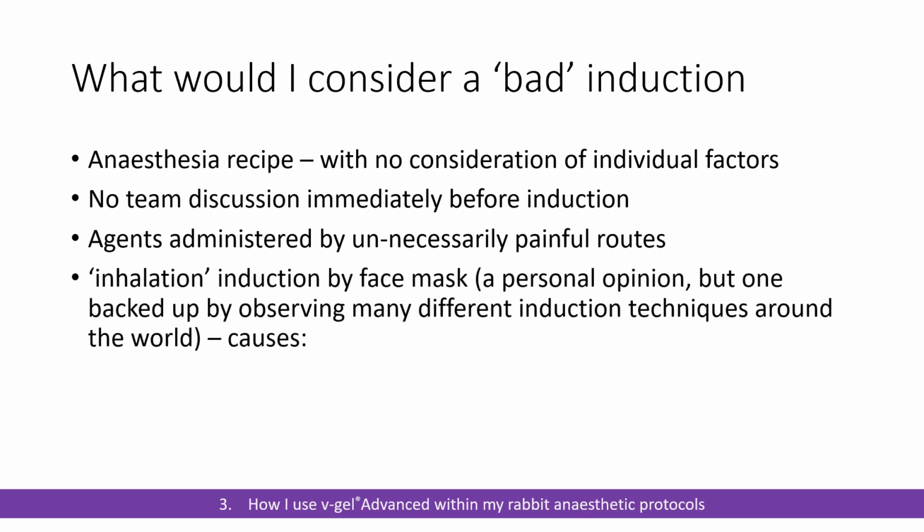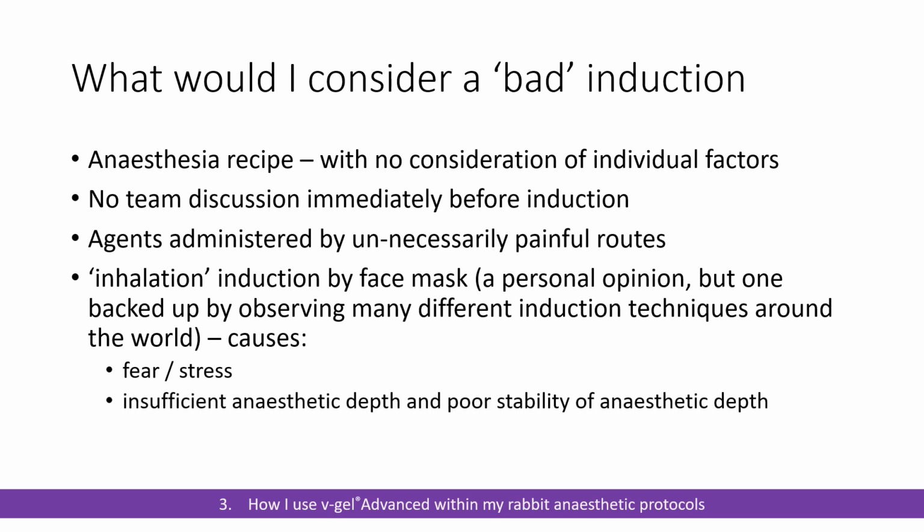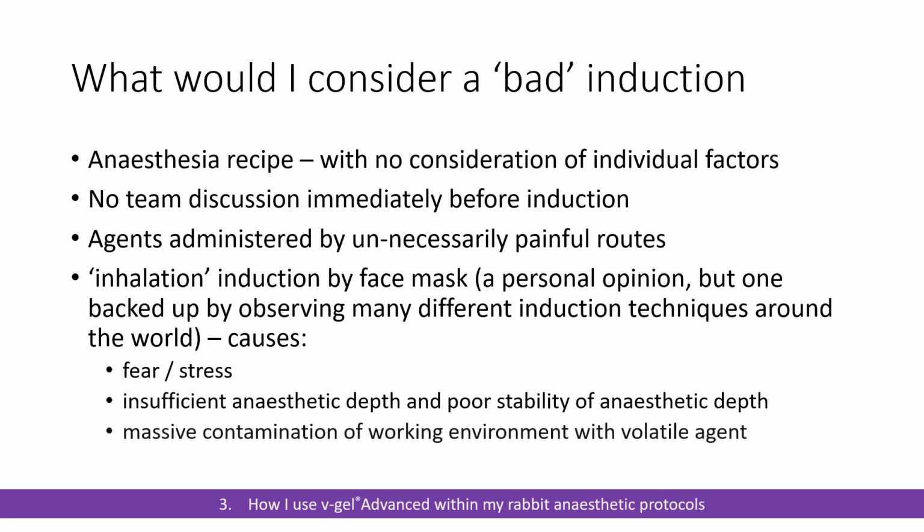And then this face mask induction or inhalation induction, I don't like it. It's massively increasing fear and stress. It doesn't give you a good depth. It doesn't give you a good stability of anaesthetic. And the most important thing from a health and safety point of view is that you're contaminating your working environment with a potentially dangerous volatile agent.